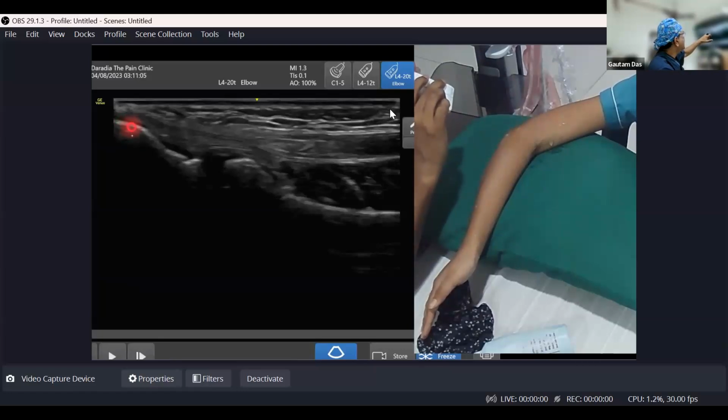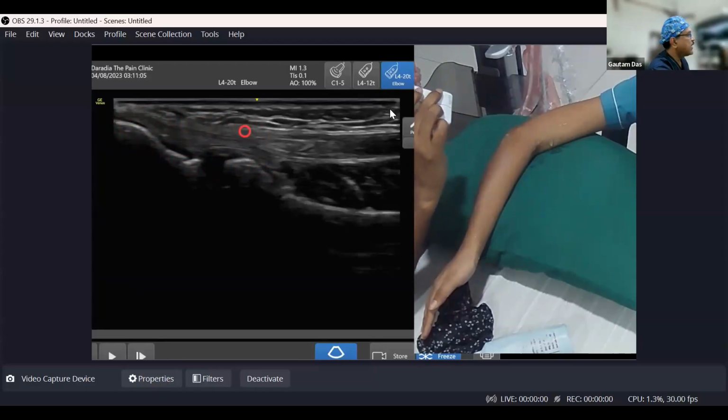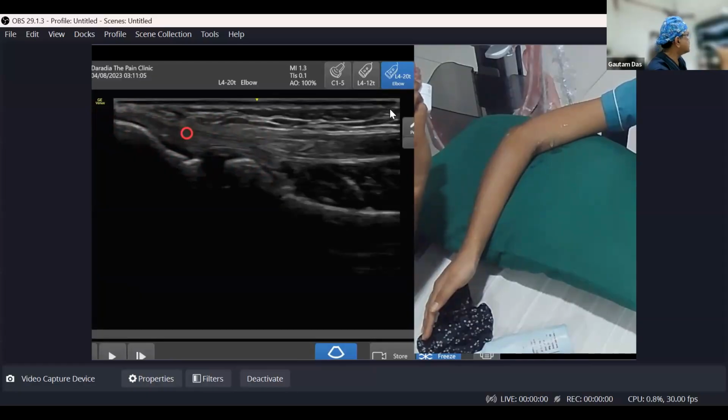So this is the lateral epicondyle. This is the slope, and this is the radius. So this is the common extensor tendon. And if you can remember, the most bulky muscle is your extensor carpi radialis brevis. Extensor carpi radialis brevis goes a little above us, and after that, the three other common extensor tendons. The total common extensor tendon has four muscles.